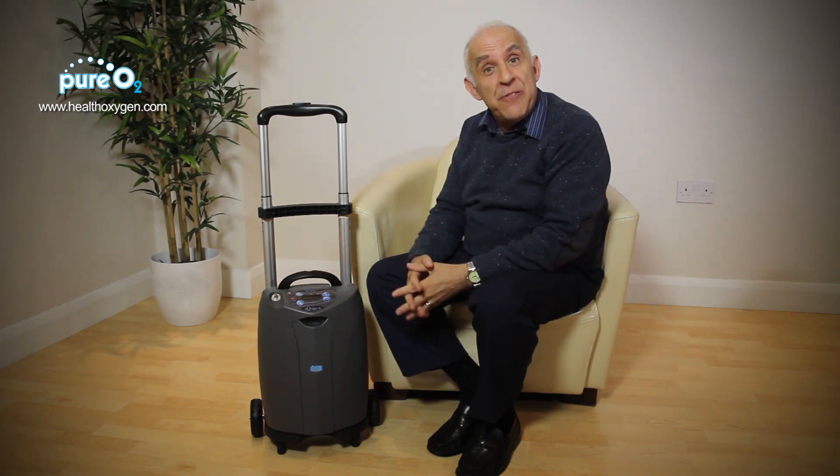This machine is powerful, light, and flexible, and weighs 6.4 kilos. It has a trolley for portability.